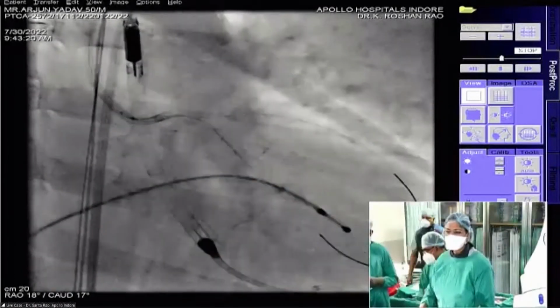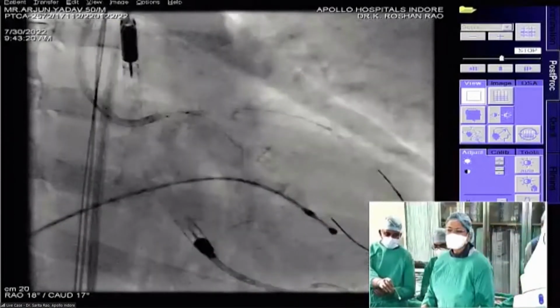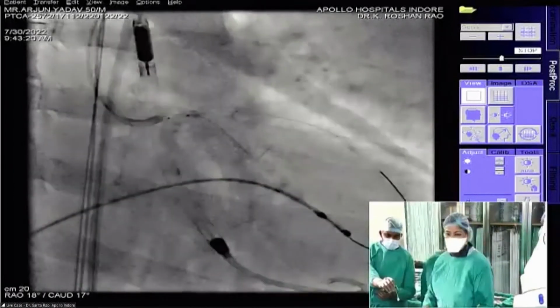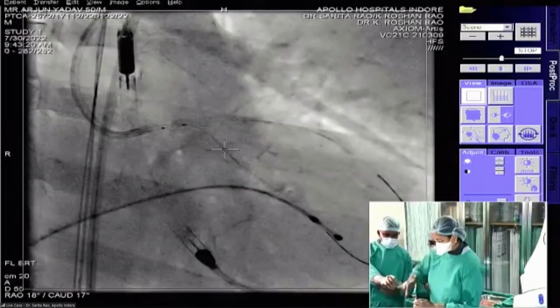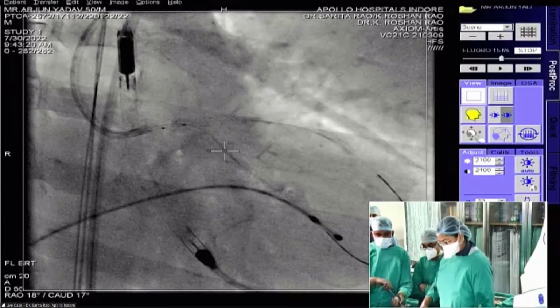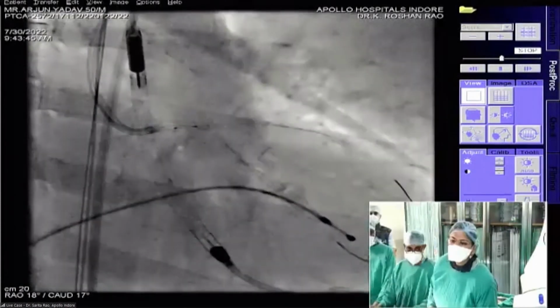Does it have a long shoulder beyond the distal marker? Yeah, while inflating it looked like it had. I think it's okay, no? It is looking proximal to the origin also. That 6 looks good, actually. No problem. Give me a small test. I think you can go ahead.